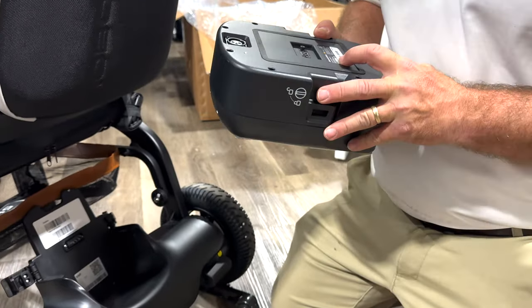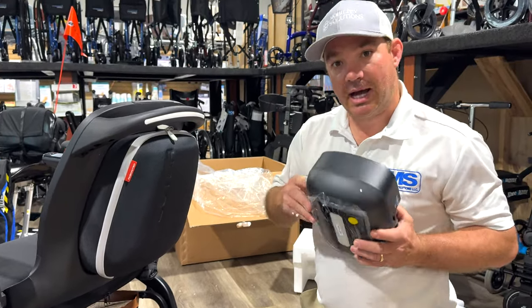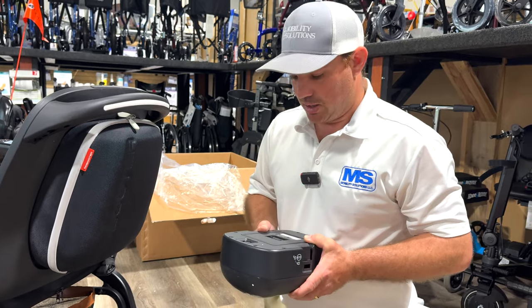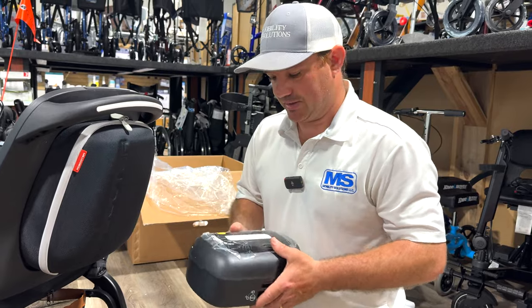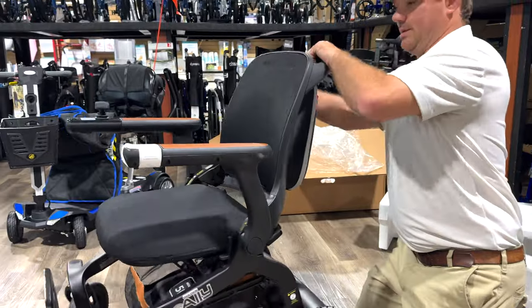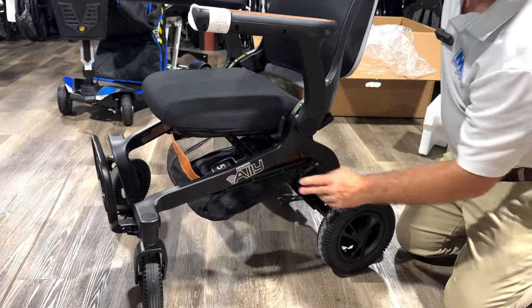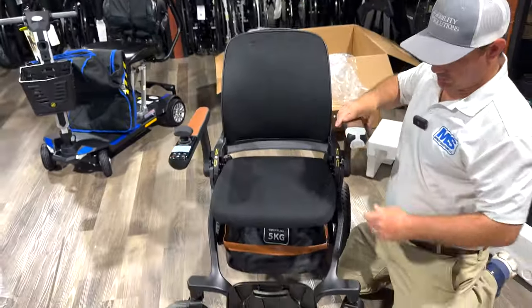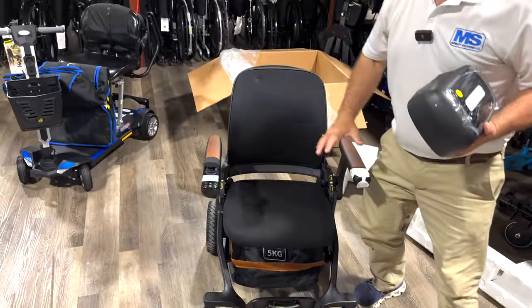Now I wanted to check the battery. So this is the 20 amp hour, 14 mile non-TSA battery. You can get the TSA battery. It's coming soon. It'll be a 9 mile. I think it's a 12 amp hour battery. So right now this is your long distance. It's in all black. They have a teal, which we'll call it green. Looks good. So let's put this thing on the charger, let it charge up for 12 hours, and then we'll show you how this thing works.